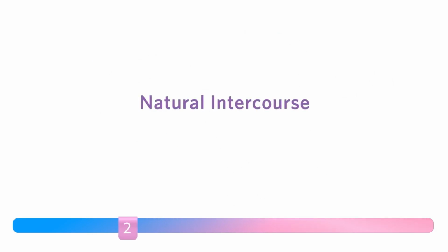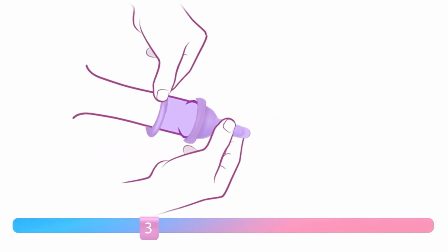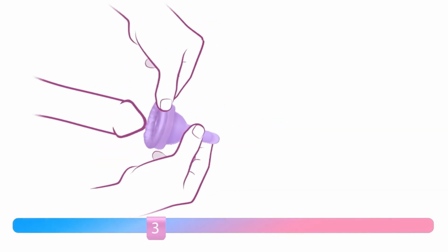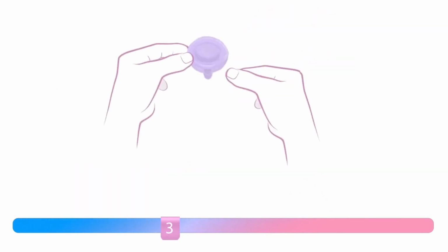Step 2. Natural intercourse. Step 3. Wash your hands thoroughly. Remove the conceptacle by re-rolling the condom to the cervical cap. Ensure the cap stays upright to prevent spillage of semen.